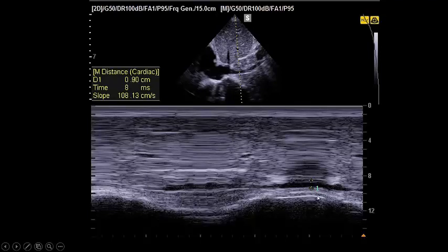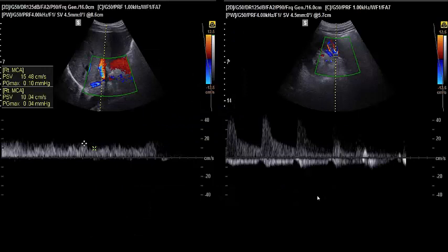In this situation, you don't need to do the VExUS score, the venous excess score, but I did it for the sake of this patient. On follow-up, you see here the renal flow, very nice, not interrupted, with systole and diastole, because of good damping of the venous flow, and also in the portal vein, not too much fluctuation.